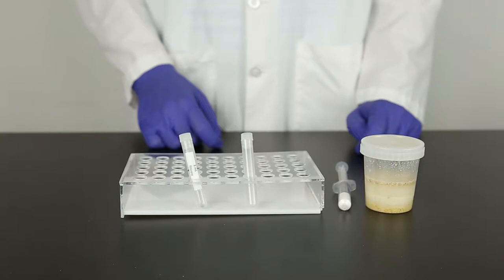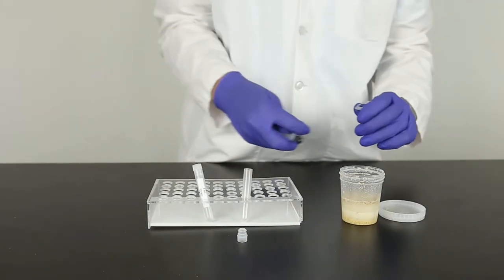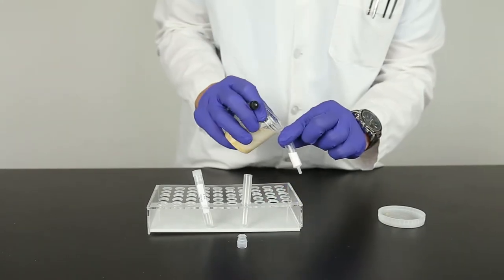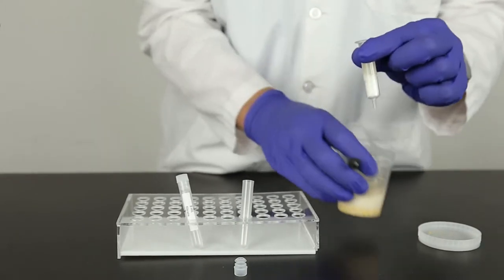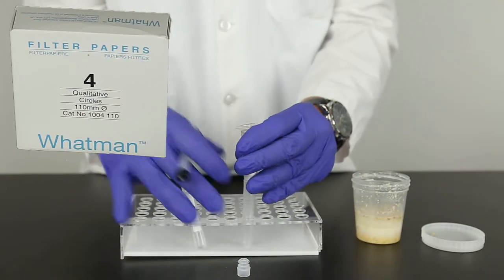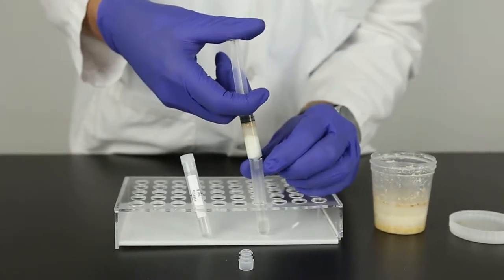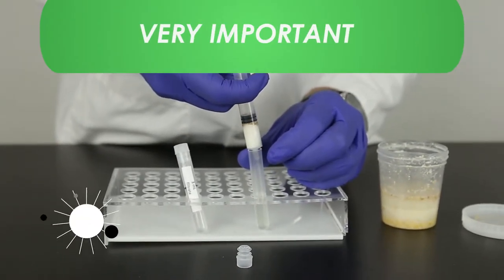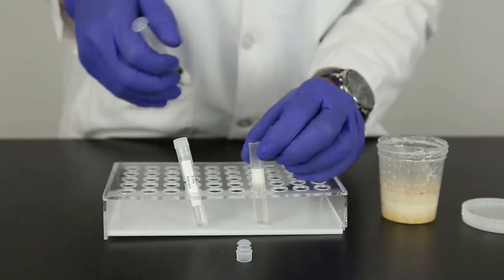Allow the sample to settle for a few minutes, then filter the extract using a filter syringe. You may also use Whatman number 4 filter or a microcentrifuge. It is very important to collect a minimum of 3 milliliters of filtrate into the sample collection tube for accuracy of results.